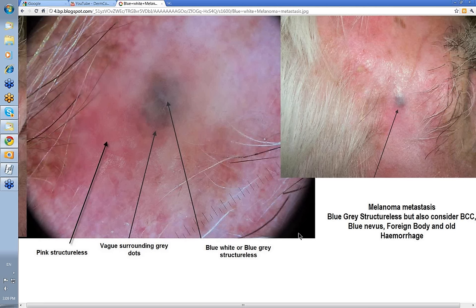This in fact was a melanoma metastasis. So blue-gray Structureless differentials: melanoma metastasis, melanoma, BCC, blue nevus, foreign body, and perhaps old hemorrhage.